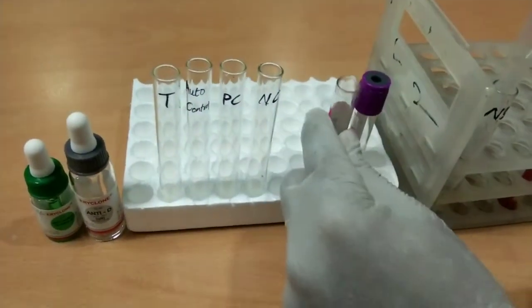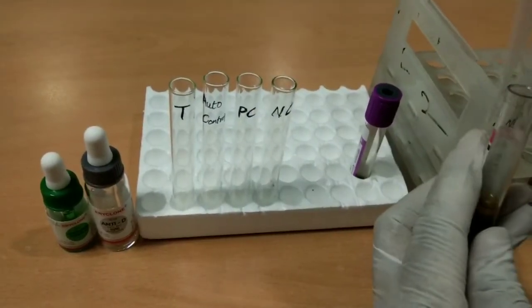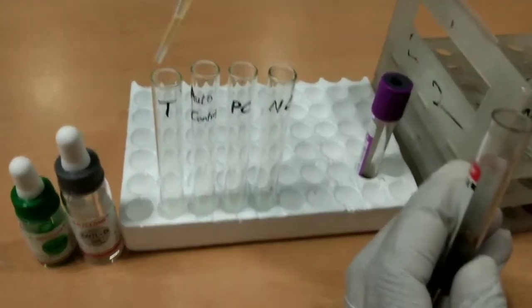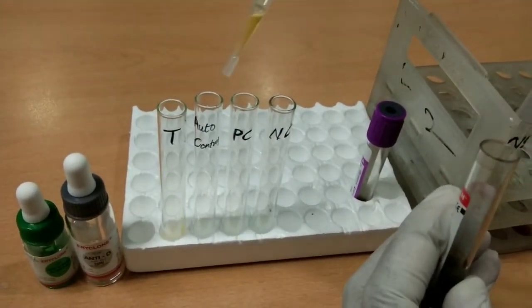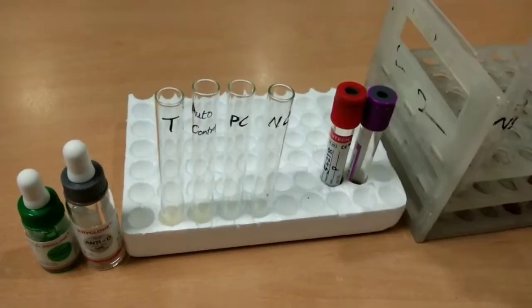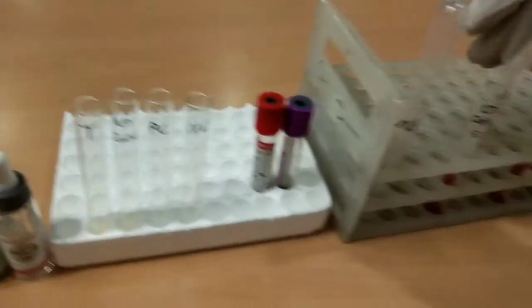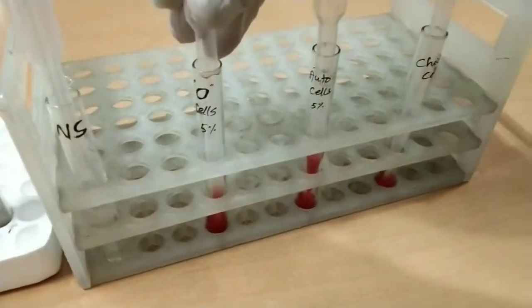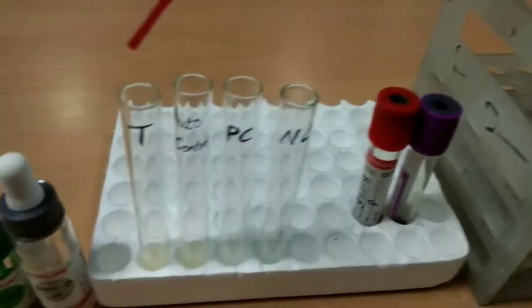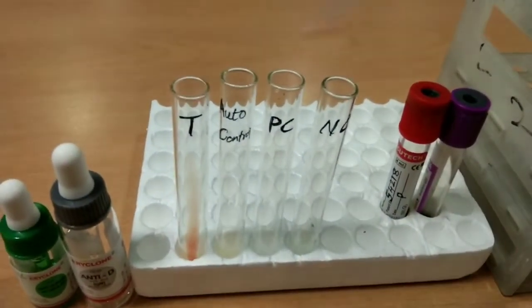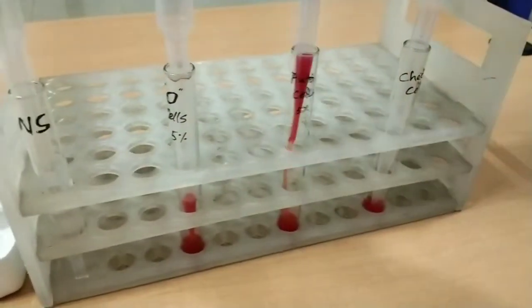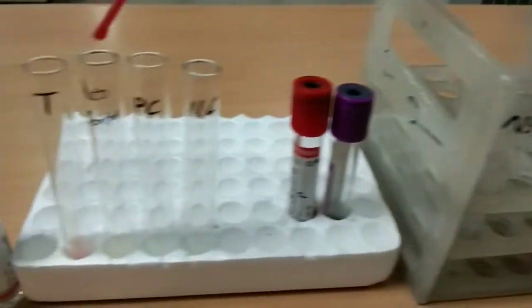Add two drops of patient serum into the test tube and two drops of patient serum into the auto control tube. Then add 5% O-positive cells into the test tube and one drop of auto cells into the auto control tube.